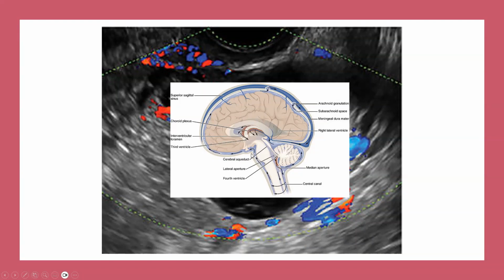But then when you come to the fluid-filled ventricular system, the margins are well seen, but the inner area is quite dark. Because the inner area has a constant propagation velocity and there's no difference in acoustic impedance, it tends to appear anechoic. So CSF tends to appear anechoic as you move down. The cerebellum has tissue which is bunched up in a very narrow, very dense area, so again, a lot of tissue here that shows a lot of reflectivity.